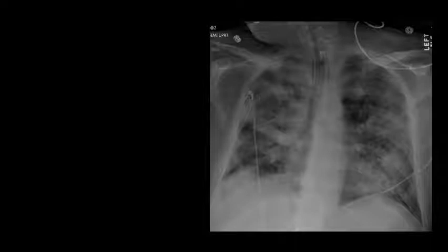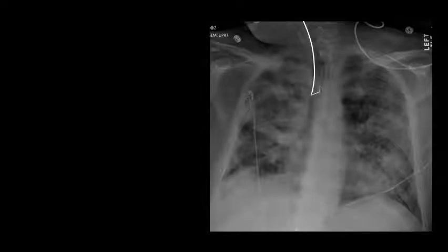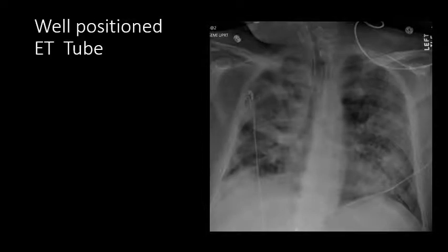Here is a real-world example. Pause the screencast if necessary and decide whether you think this is an appropriately positioned endotracheal tube. We see the tube well-demarcated by a bright white line, which helps increase the visibility of the endotracheal tube. This white line terminates in appropriate position approximately 5 centimeters above the carina. So this is a well-positioned endotracheal tube.